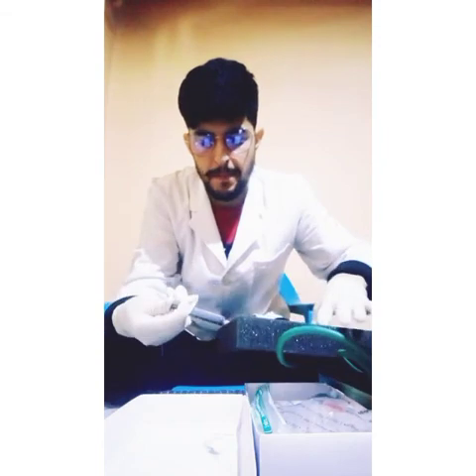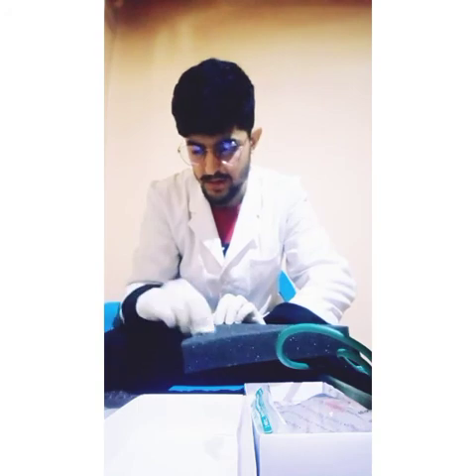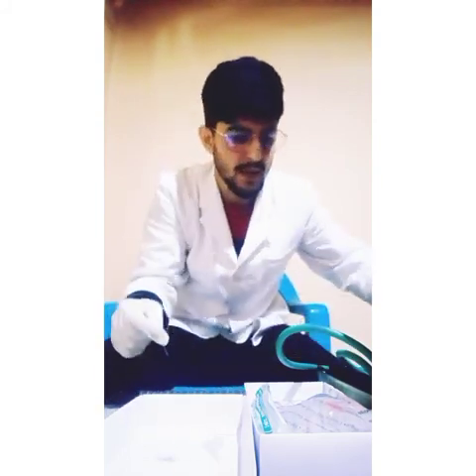Administer it slowly, and then take the needle out, and dab it with the cotton using alcohol. There will be an elevation, a type of swelling. We use the cotton to clean that surface and put the cotton in the medical waste B. So this is how we administer. Thank you.